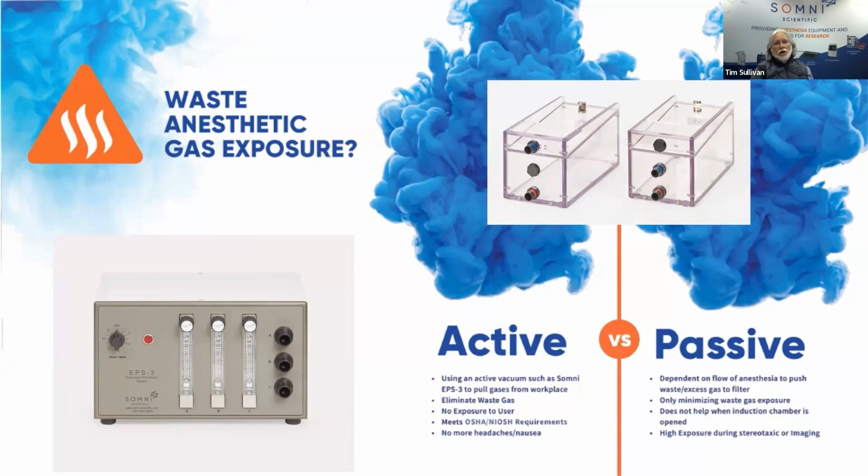So Chase has talked about the vaporizers and the anesthetic agents, and we've gone over the different delivery systems to a certain extent. Now we're going to talk about the other side of the equation, the waste gas, or the WAGs. The waste gas is the unused anesthetic agent that's left over that the animal hasn't breathed or used. So there are two methods of dealing with the unused waste gas. One is a passive system, and one is an active system.